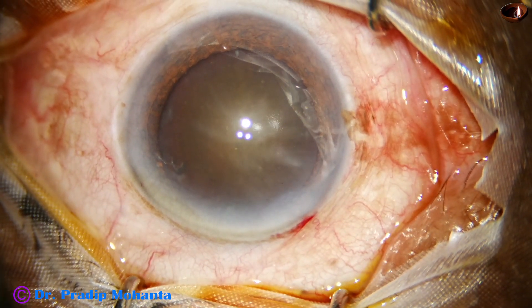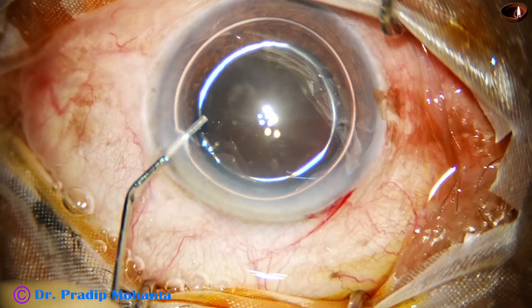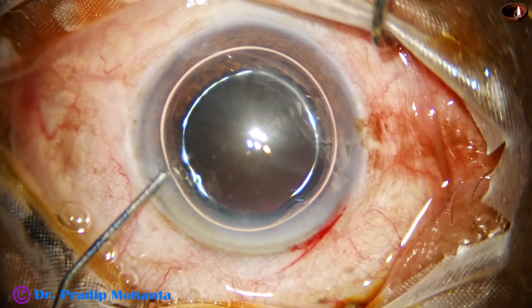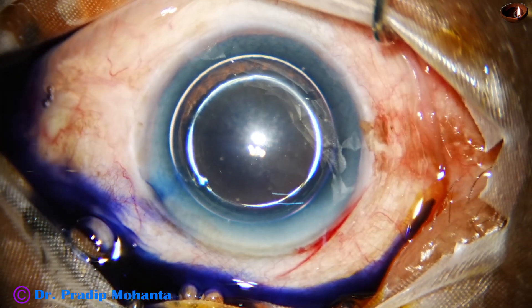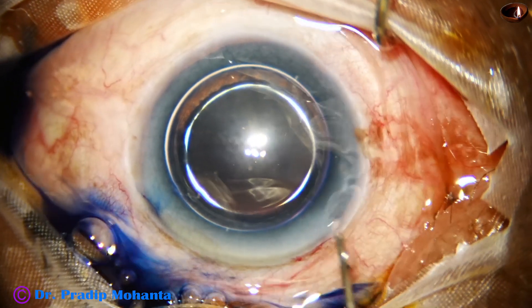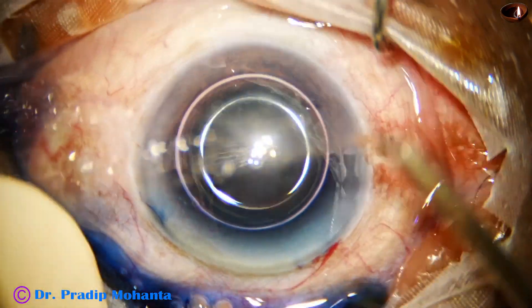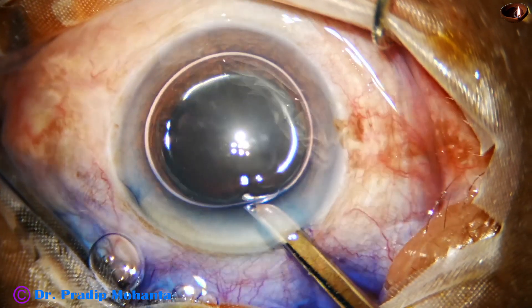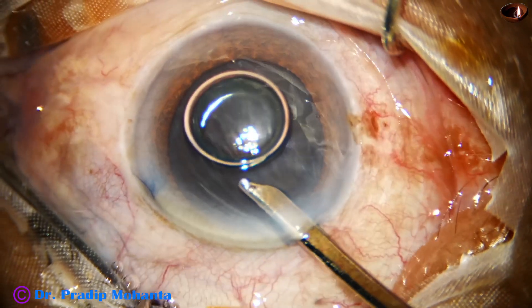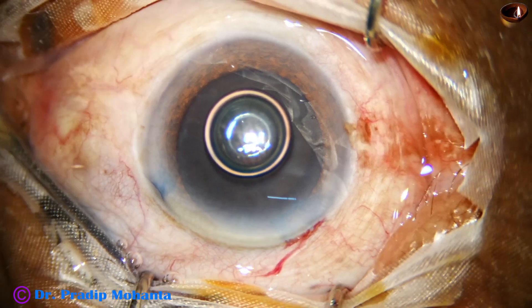An air bubble has been injected in the anterior chamber, and then trypan blue dye is injected over the anterior capsule. This is adrenaline — it may help in maintenance of the dilatation of the pupil. The dye is washed out. Many colleagues just replace the air with the visco; that is up to you.